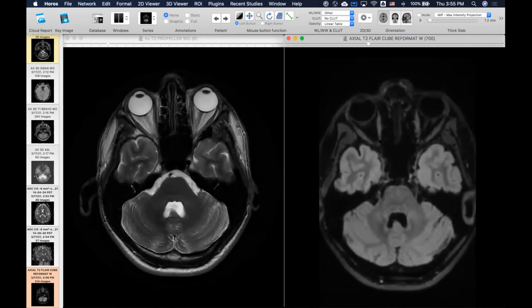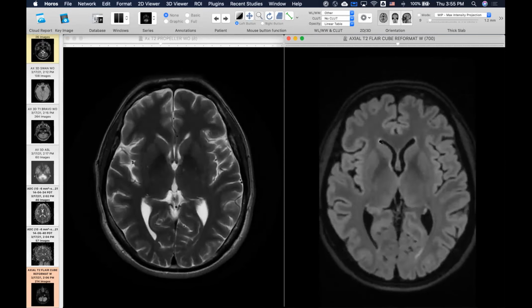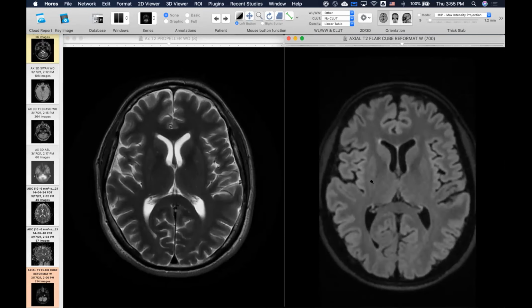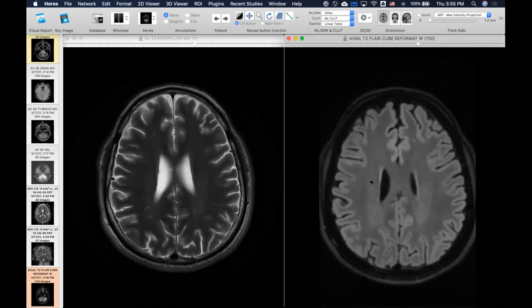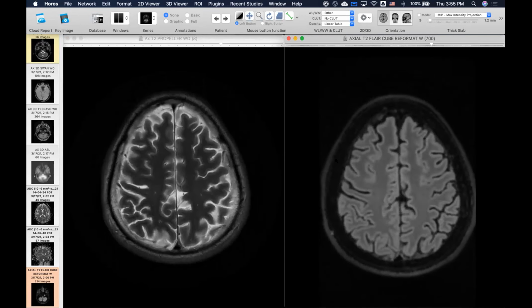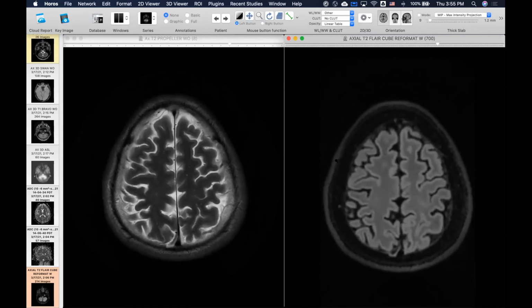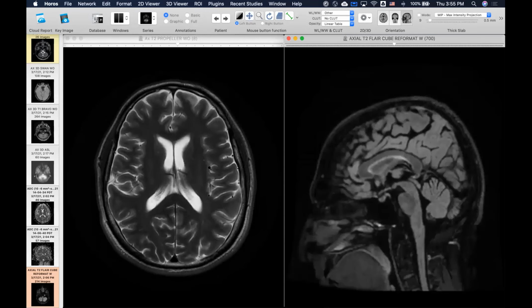This is really, I mean, it's really a useful sequence, by the way. And the right-hand one is actually a 3D sequence. So you see there's way more slices. It's much higher resolution than the left one, which, you know, only once in a few refreshes starts showing up. You can also actually see this if I reformat.